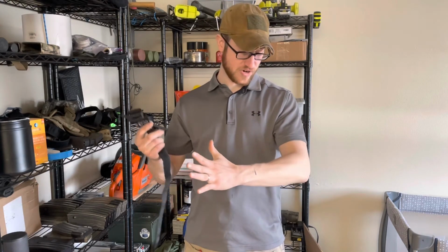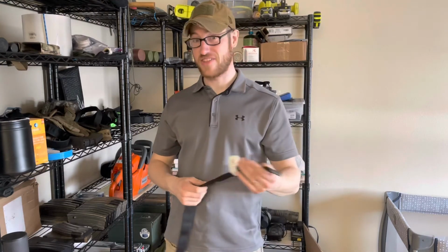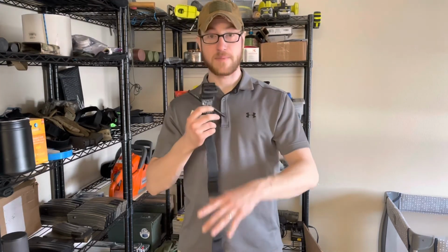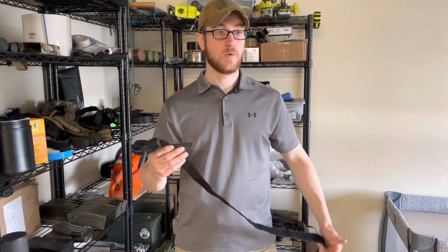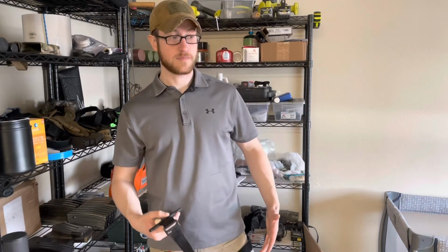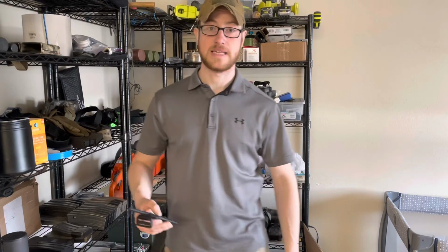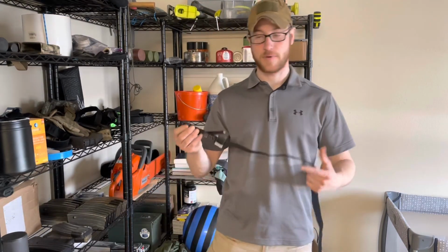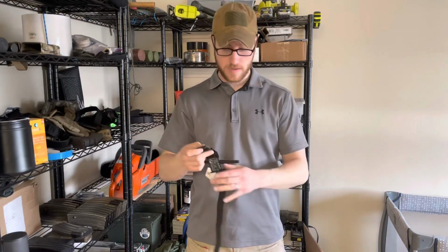The lower the tourniquet is, the less of your limb is going to be affected by the tourniquet, obviously, and everything below the tourniquet is going to be basically unusable. So let's say you have a patient with an amputated foot and you put the tourniquet high and tight on the thigh. You've just basically taken use of that entire leg away, rather than just putting it below the knee, and now the person can actually bend their knee, get into vehicles. If you have the time, I personally prefer to just put the tourniquet where it needs to go, my opinion.